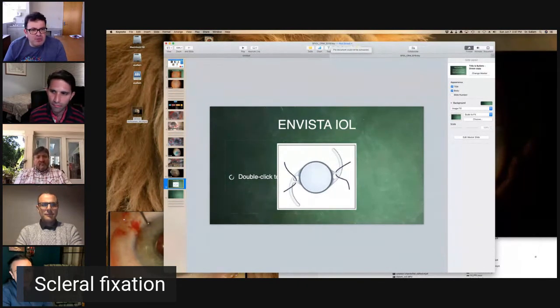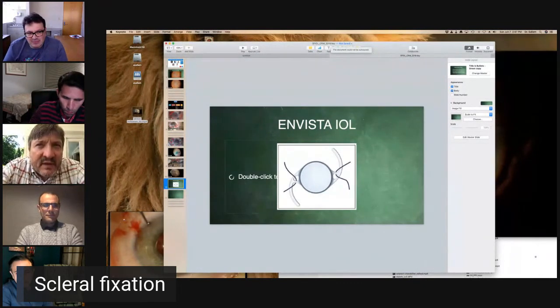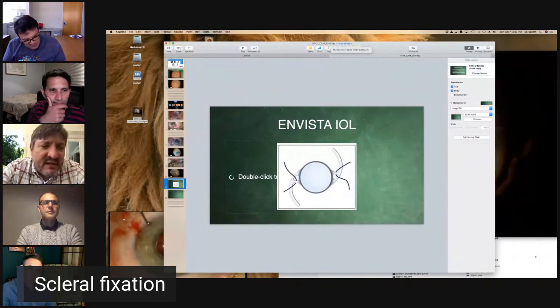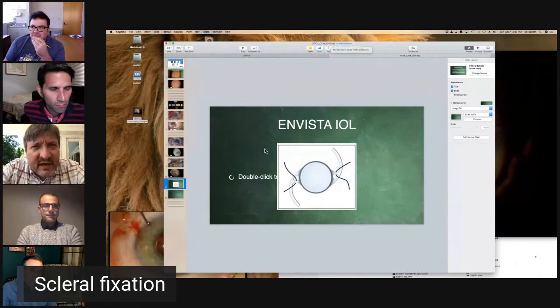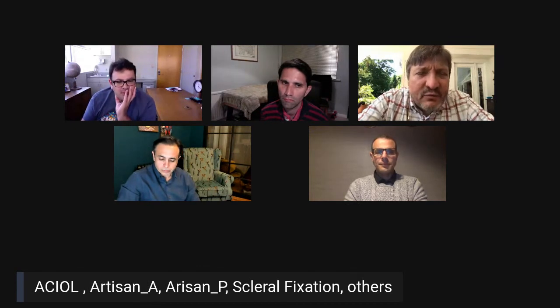Chris, do you have a word of wisdom on that? On the aphakia and IOL correction? I think that if you do a literature search on this subject, you will get hundreds of papers with hundreds of different techniques. And what that tells you is none of them really works really well. You've got to assess your own skill set, what's feasible to do with your nursing staff and your scrub staff, and what instrumentation you have at your disposal. The good news is that there's a lot of options out there. The bad news is none of them are great, and you just got to do what works best for you.